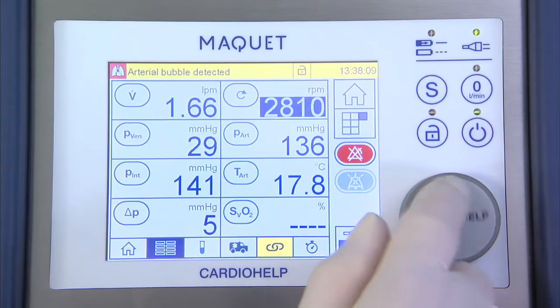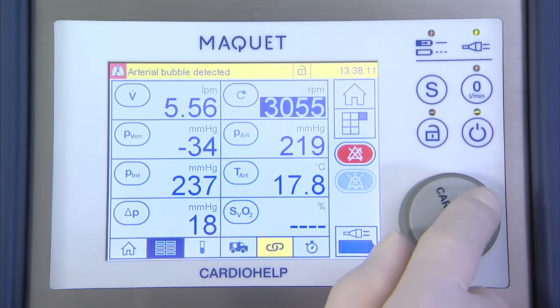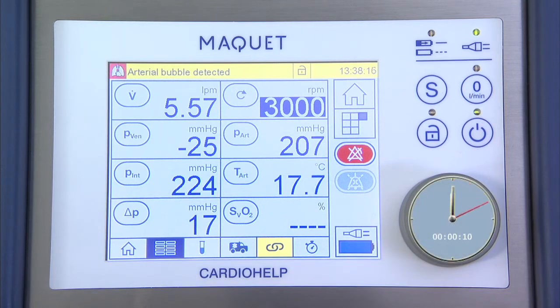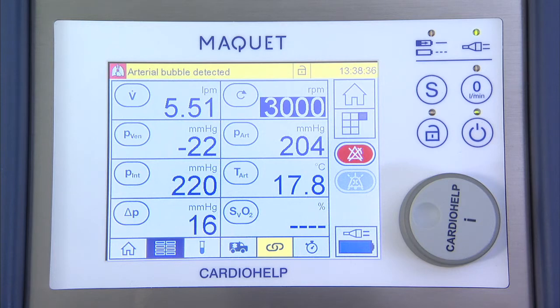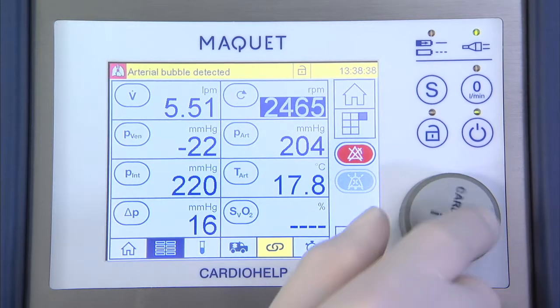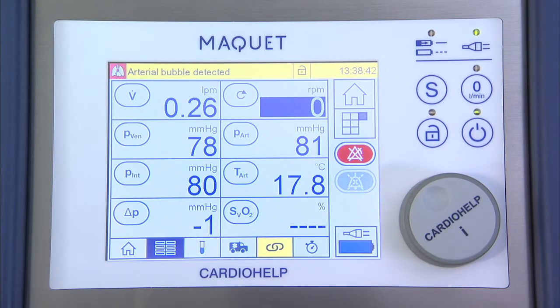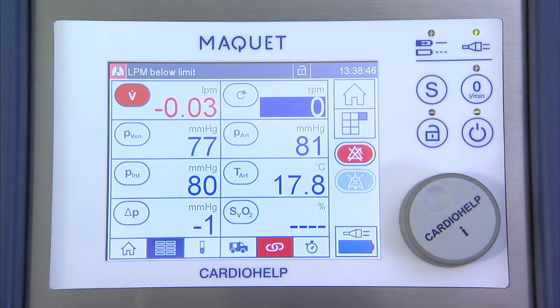Set a speed of 3000 revolutions per minute for two minutes. Then set the drive to zero revolutions per minute for at least five seconds and reset the bubble alarm.